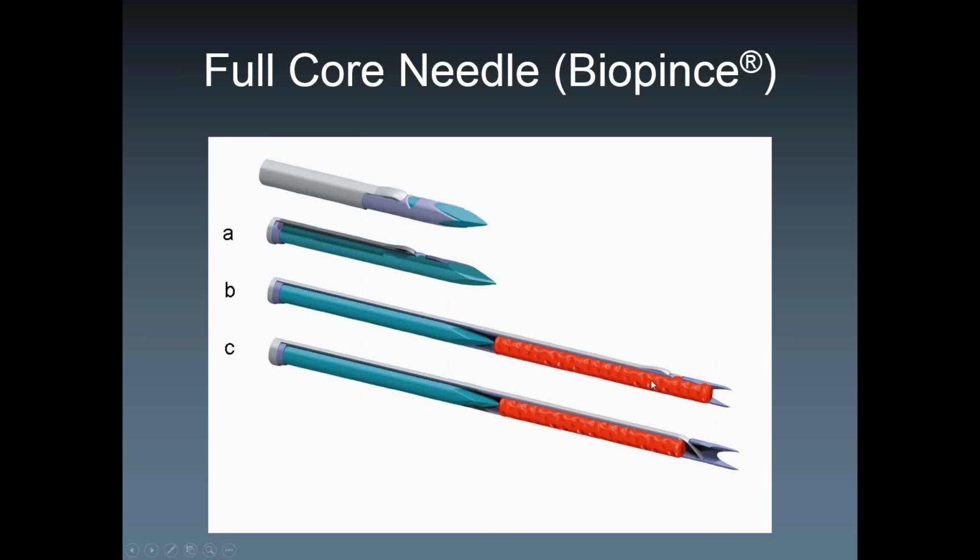So I'm not using this one, for example, for lungs also because it's too large. Too large meaning, I'll talk about literature in a minute, that 16 gauge and 18 gauge are high risk biopsy devices for lungs compared to 20 gauge. So there's a risk of pneumothorax and bleeding independent of the size of the target, of the device, sorry. But this is a very nice device for full core solid organ biopsy. It's pretty safe and mostly works most of the time, obviously.